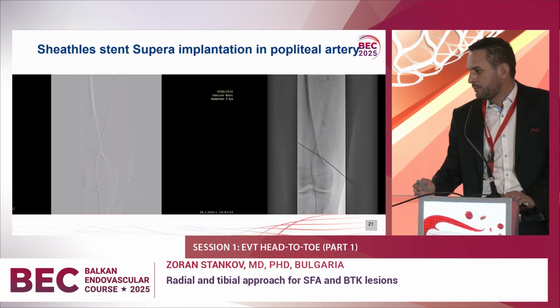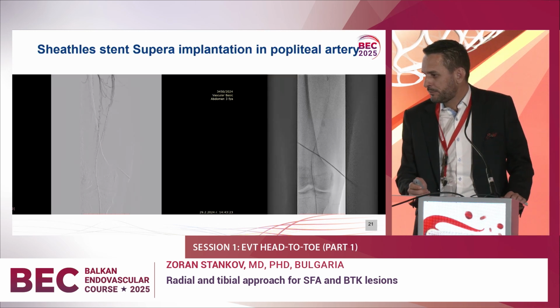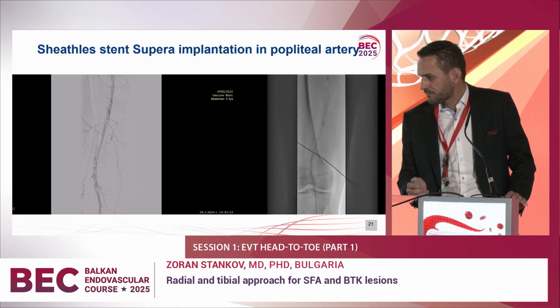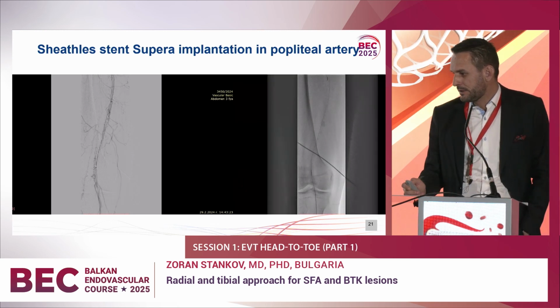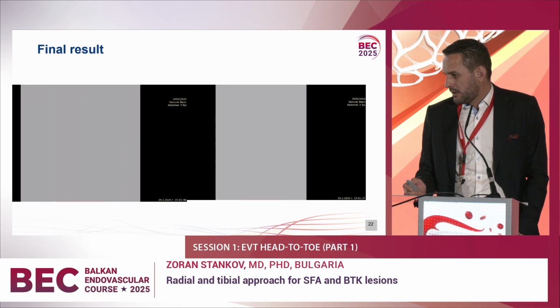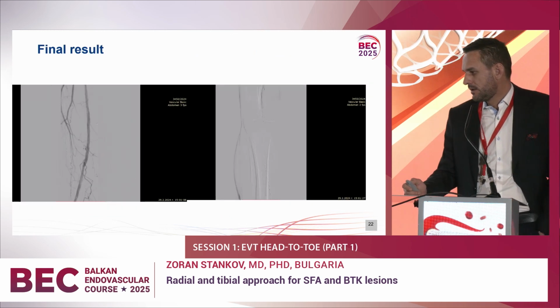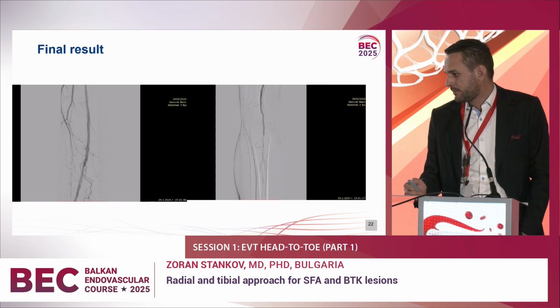After that, sheathless, we implanted a Supera stent in the popliteal artery, a stent dedicated and indicated for the popliteal artery. Final result for the distal SFA, and final result for the popliteal artery.